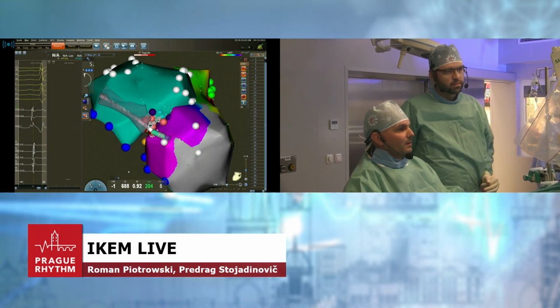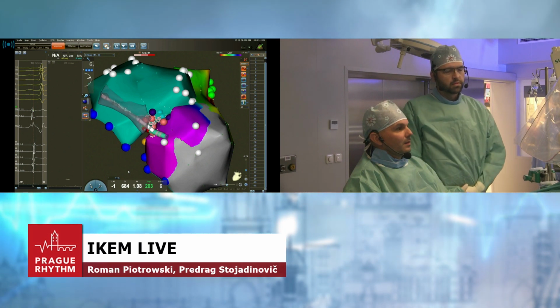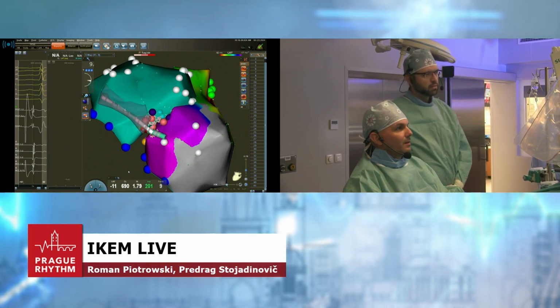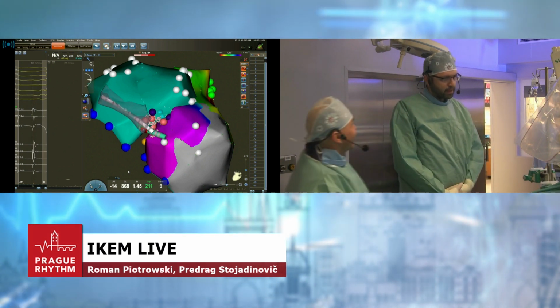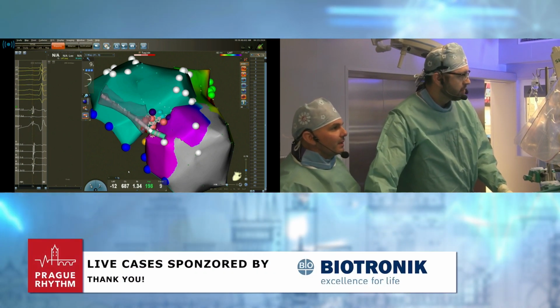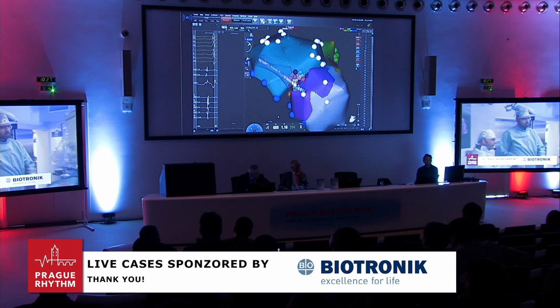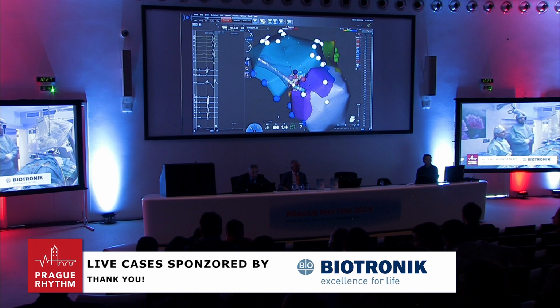How do you pace the vagus? It's a high frequency, high energy stimulation from this off-label stimulator. As Dan mentioned, there are some companies which produce them, and probably they will be producing more, as there will be more widespread use of neuroablation. That's the problem so far, because it's not available to everybody at the moment. Or maybe if you search, you can get one.